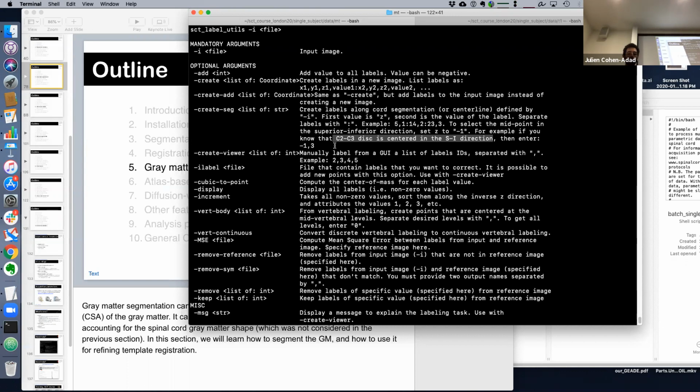Right. So the best way is maybe you can send me 1 or 2 representative data. And then I can see what's the most automated solution that I can find for your data. I've tried with this case with radius by reducing them, but it also depends on the time. Yeah, no, but I will try to smooth along the centerline to improve the contrast. That's the first time I heard about smoothing before. Yeah, I will try that.